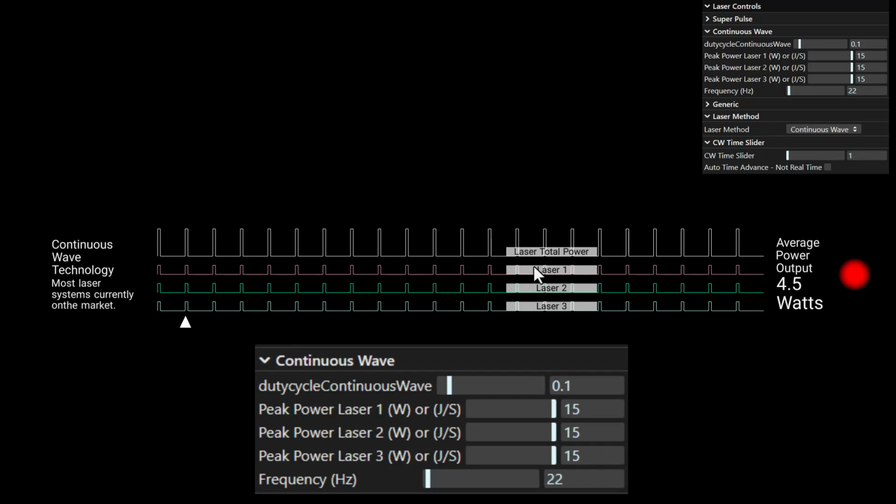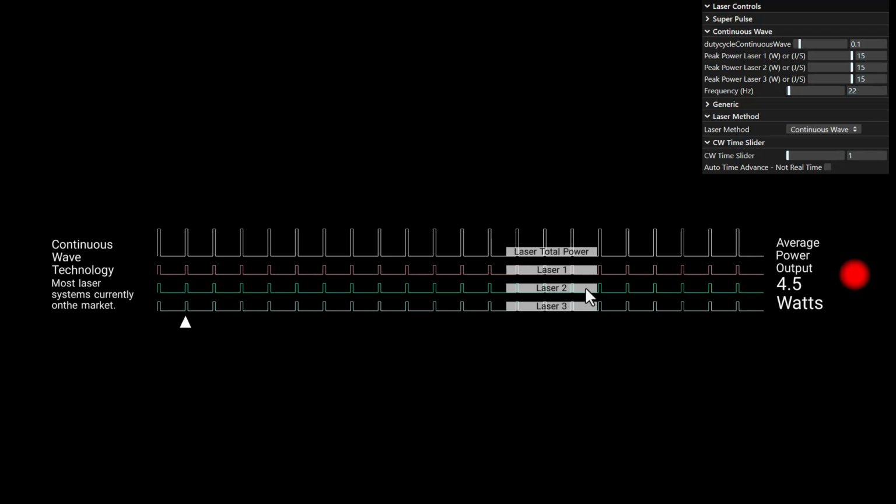Now the nanometers of the lasers also determines depth. A laser that's at 1064 nanometers will get deeper than a laser that's red, at 635 nanometers. It's just a fact of physics. And if you go further into the infrared spectrum, say to body heat level or that of a heating pad, well, that really penetrates well. Unfortunately, at these wavelengths, there's not enough energy per photon to affect the mitochondria to get the muscle relaxation, pain relief, and regenerative effects that we're looking for. So there's a lot of factors that go into these lasers and understanding your machine.